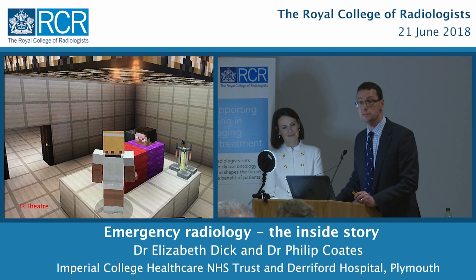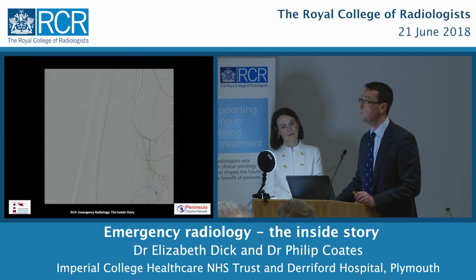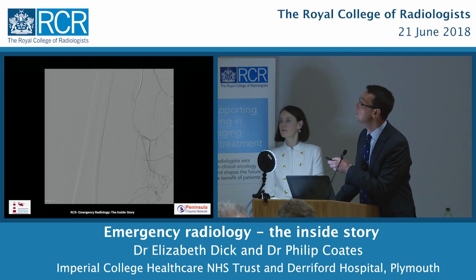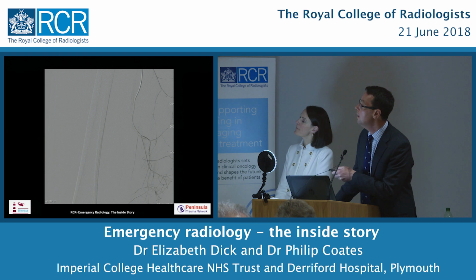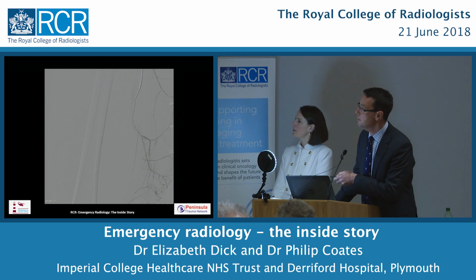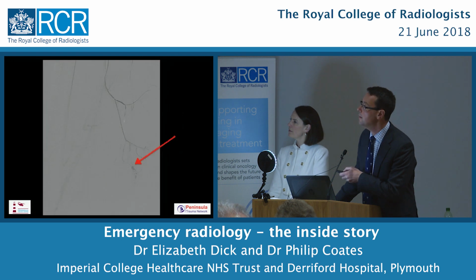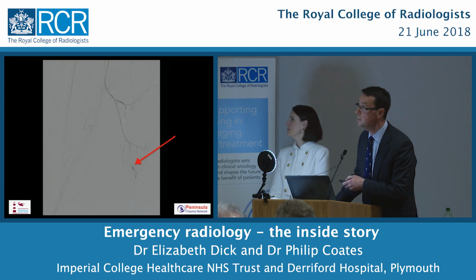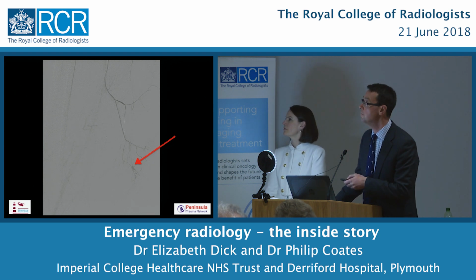So the approach to this is we go into the femoral artery at the groin and work down the leg. There's a catheter here, and we've gone into this tiny side branch. There's some evidence of mischief, of possible bleeding a bit further down here. Okay, and if we mag up on that area, this blob here is suspicious for the bleeding point, which we've seen on CT. The CT has guided us in on this intervention.